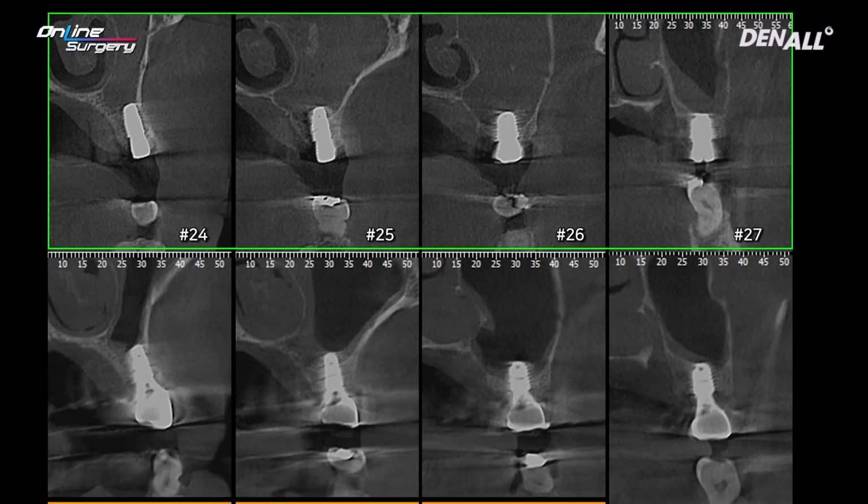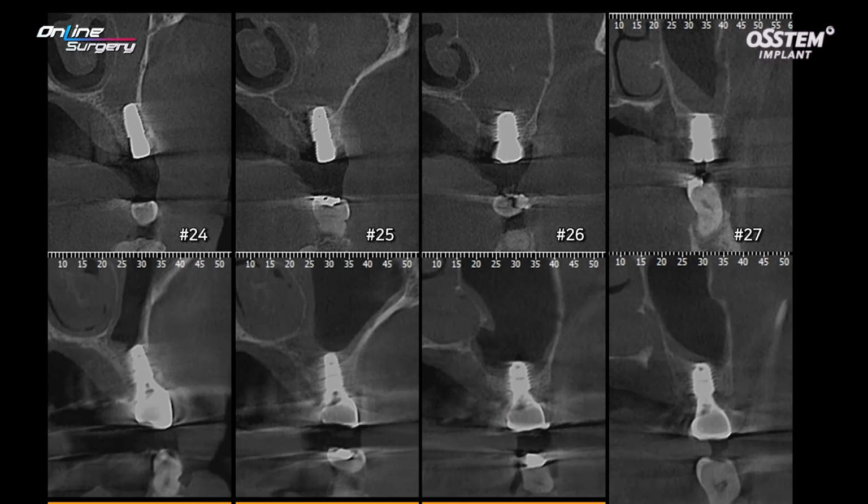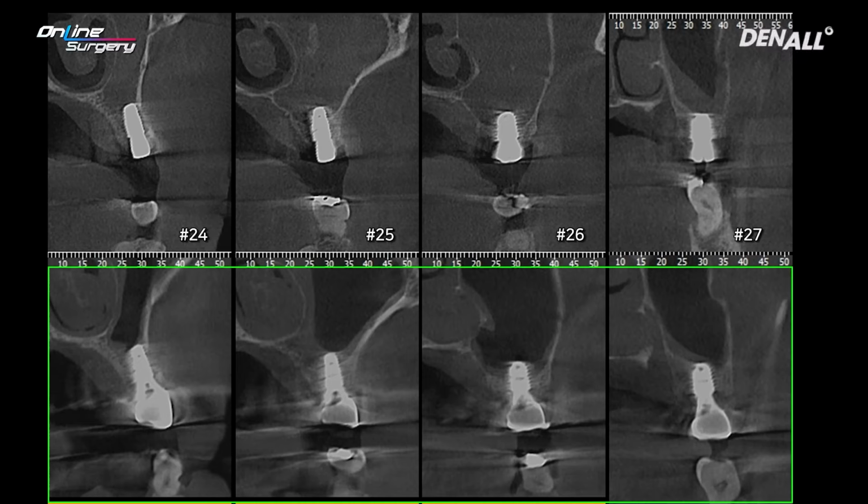After surgery, when I checked the CT, the membrane was completely perforated. Upon surgery, when I did aspiration, there were no bubbles, so I thought that sinus lift was done properly and I put in alloplastic LCR material. However, you could see here that sinus membrane perforation occurred. This is after treatment in the bottom. About 4 months later, I completed the treatment. The sinus looks clean.